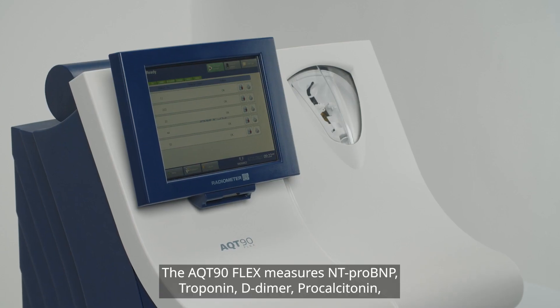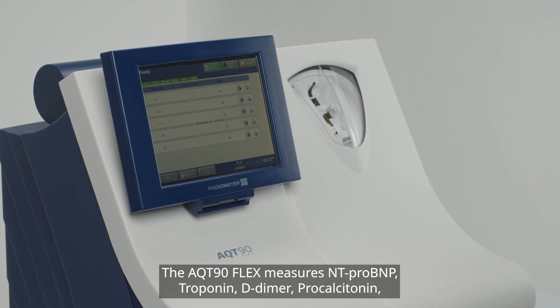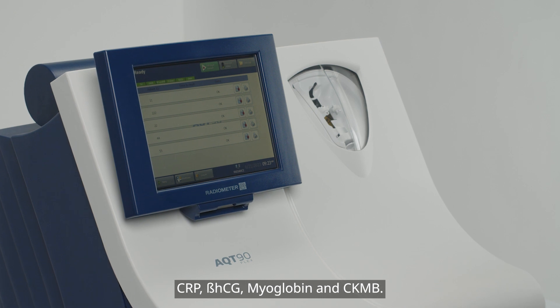The AQT90 FLEX measures NTproBNP, troponin, D-dimer, procalcitonin, CRP, beta-HCG, myoglobin, and CKMB.